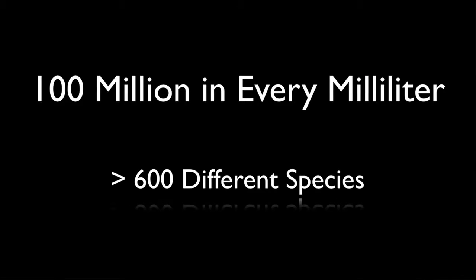This is what's in 1 milliliter of saliva. These bacteria are just waiting to get into your case and causing your treatment to fail. So this is the main reason why we're using rubber dam, is to follow an aseptic protocol.